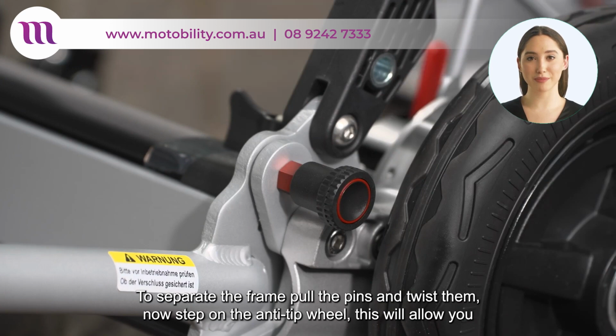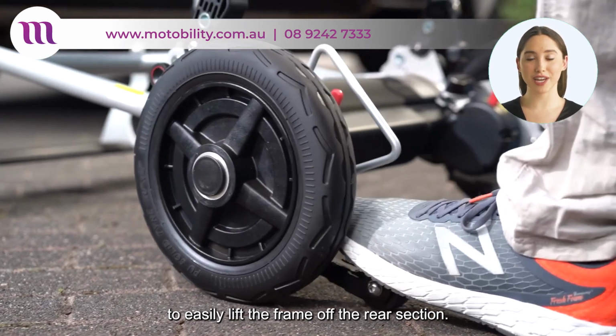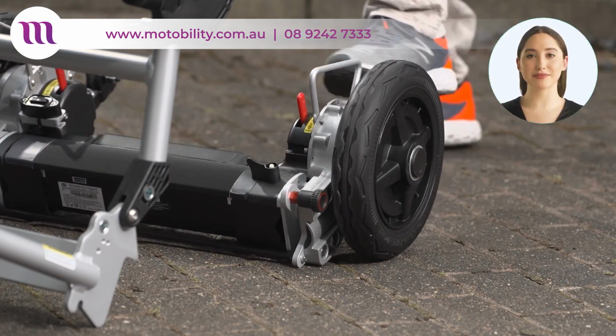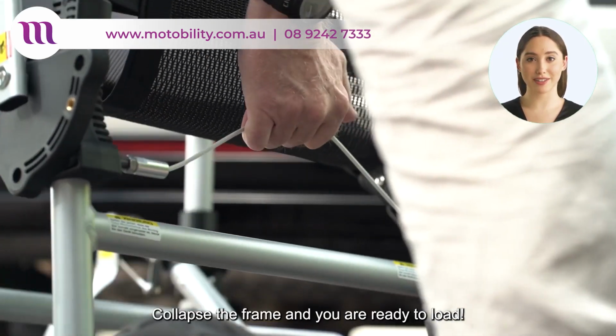Now step on the anti-tip wheel. This will allow you to easily lift the frame off the rear section. Collapse the frame and you are ready to load.